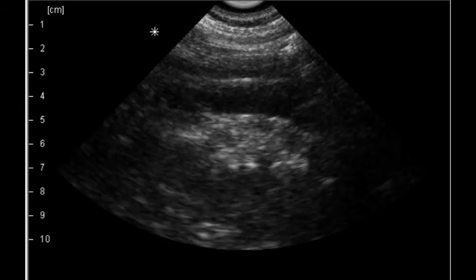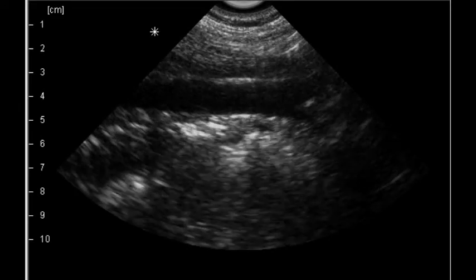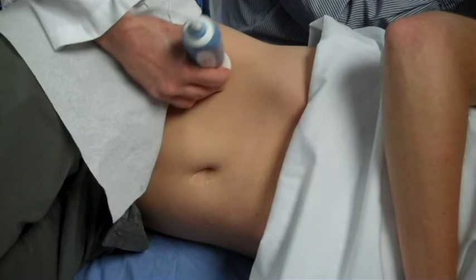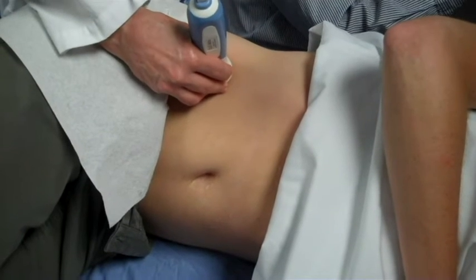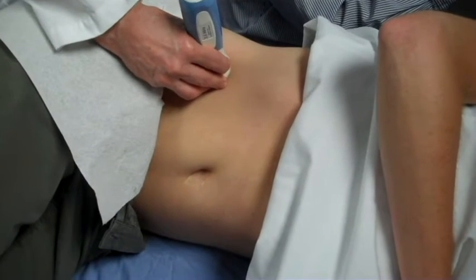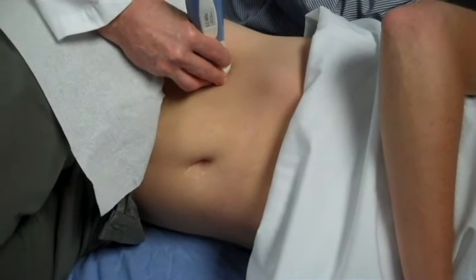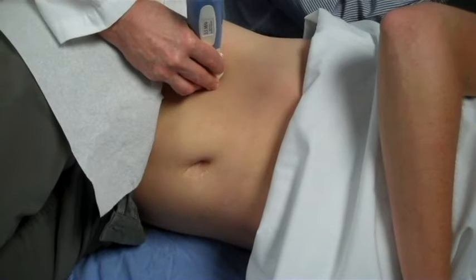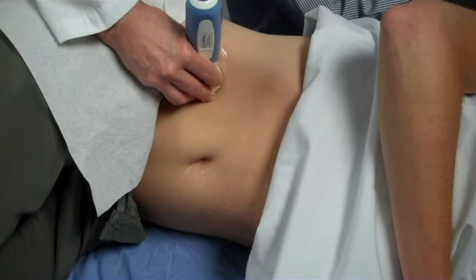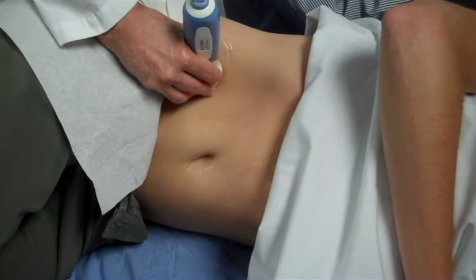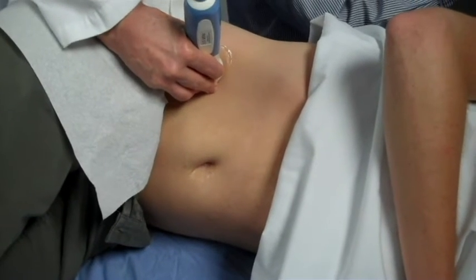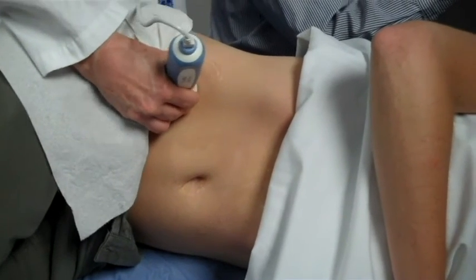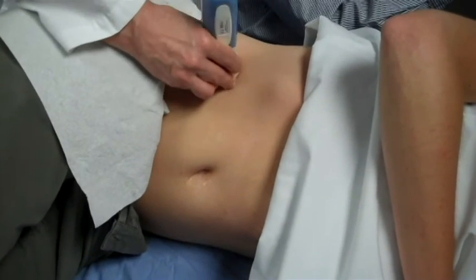You can make measurements in the longitudinal plane by rotating the probe 90 degrees. If a gas-filled transverse colon obscures the aorta, move the probe until you find a sonographic window. In some patients, it is easier to visualize the aorta by coming in from the side. Exerting pressure to displace the bowel can also be helpful in many cases.